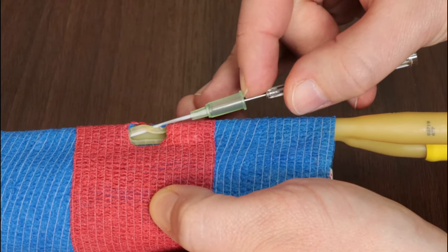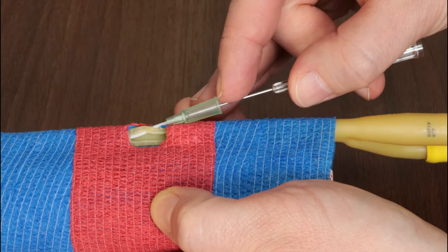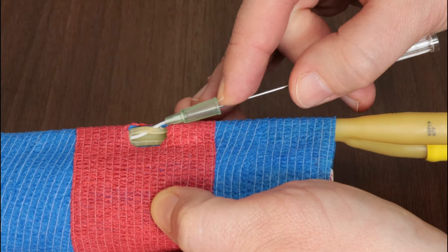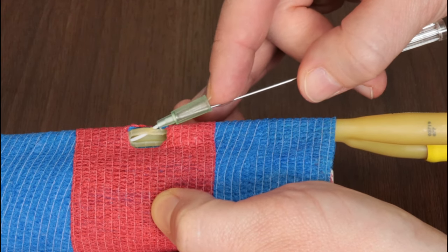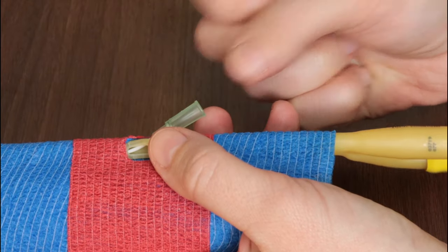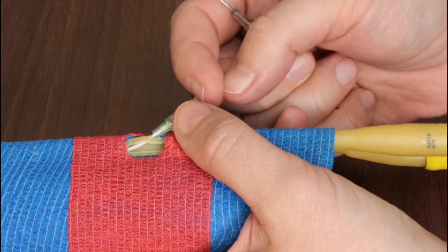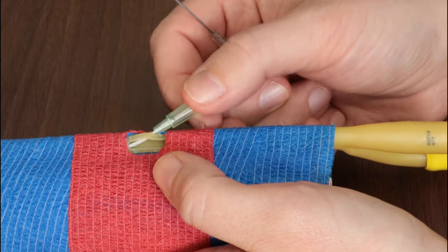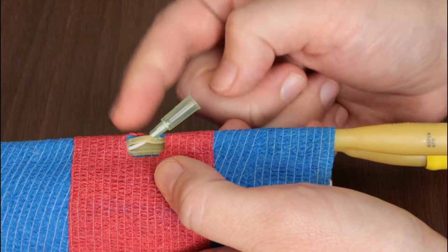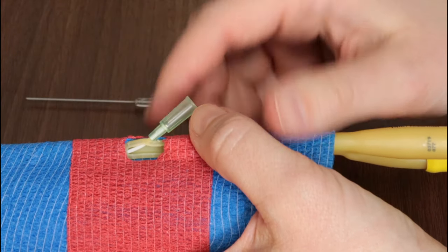This does have a little bit harder push than normal skin, I will say that, than a normal small animal catheter, just because of the nature, the thickened wall of the Foley catheter. And in real life, when you're doing large animal work, their skin is quite a bit thicker, so you will have a little bit harder push, but it should always be a smooth push if we're where we need to be in getting that catheter into place.